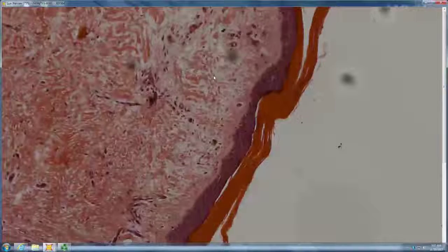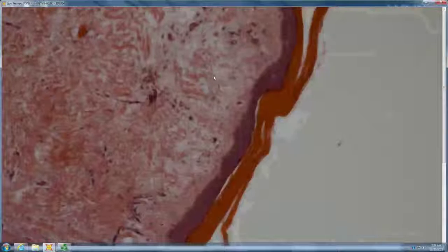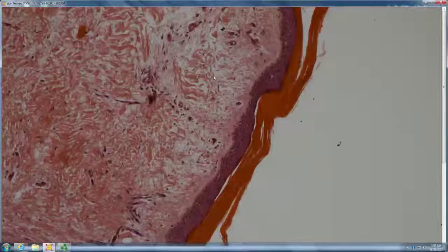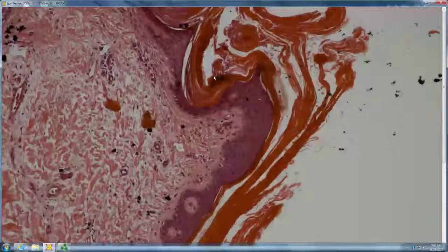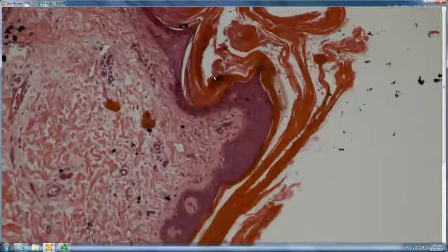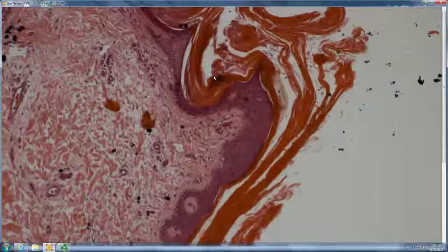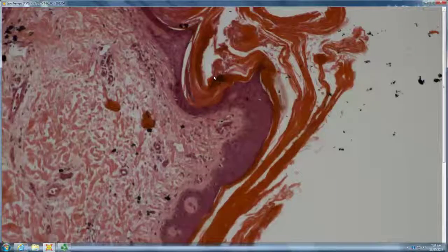Okay. Brett, are you passing or playing? Alright, so very compact, thick, very red. So it's like an ichthyosis vulgaris. More likely hyperproliferative or, well, it is a little retention. Lamellar, but it's so pink. And is your epithelium particularly thick? No. That's one of the hints in lamellar ichthyosis, that you have epidermal hyperplasia as well, because it's a hyperproliferative ichthyosis. So lamellar and EHK are hyperproliferative, whereas X-linked ichthyosis tends to be just retention.